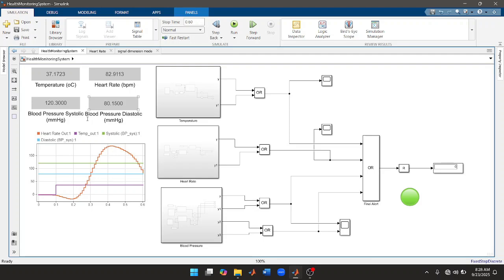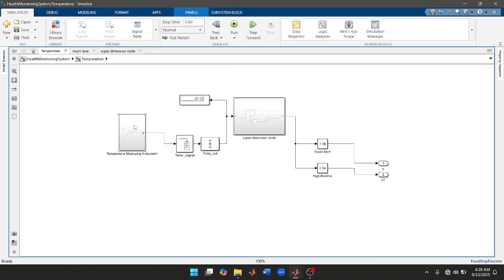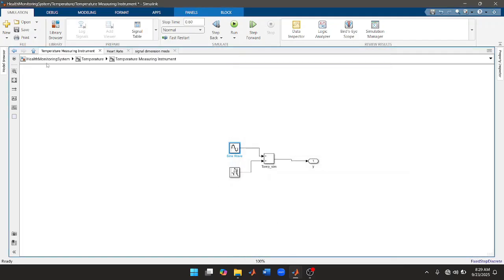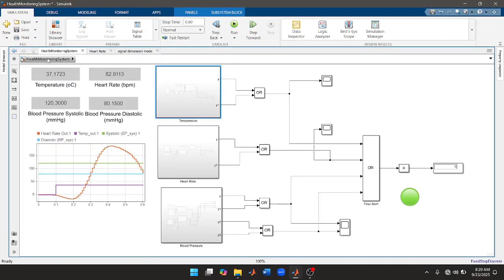Now, if we increase this temperature, let's say we increase our temperature signal to 39. That means the equipment is now measuring 39 degrees Celsius. We can simulate and see that the temperature is 39 degrees Celsius. Now you can see that we have a red alert. There's a fever alert now. The temperature has increased. You can see the signal reading from this dashboard. So this alert now shows that the temperature has increased.